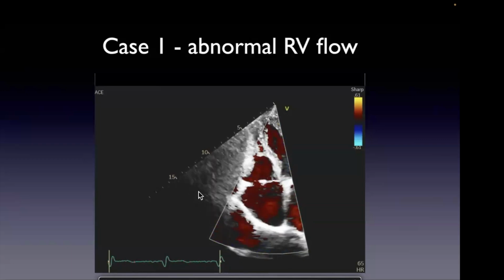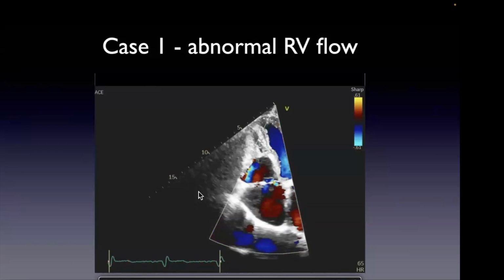Okay, that's possible. VSD? Well, why do you think VSD? Well, it's a blue jet away from the transducer. Yeah, that's a good thought actually.